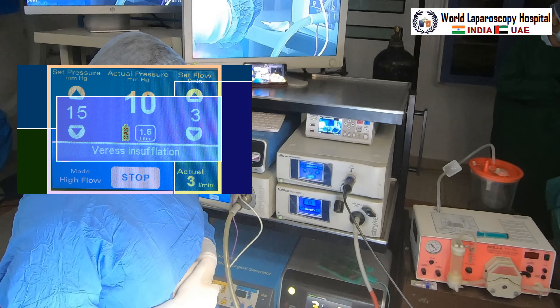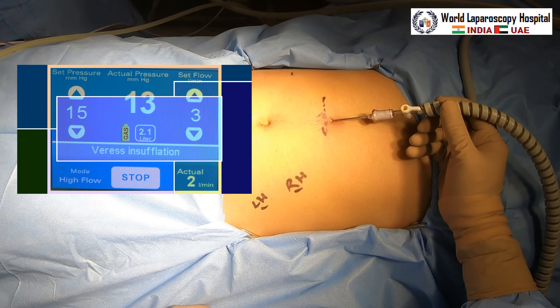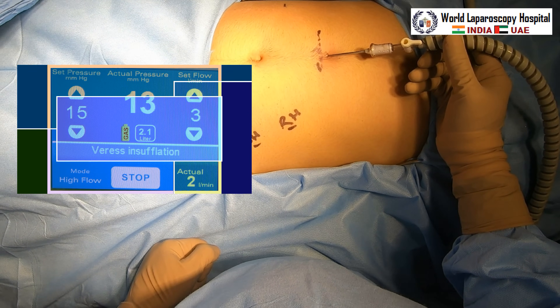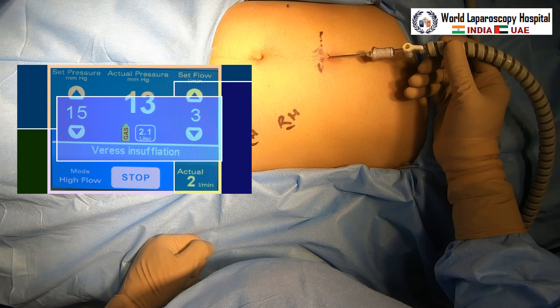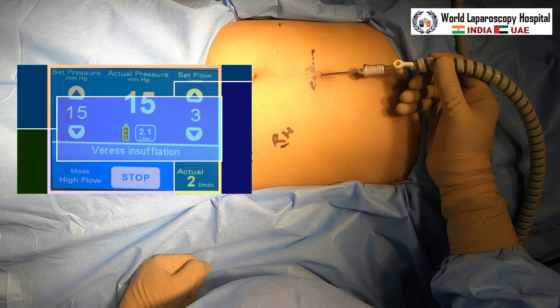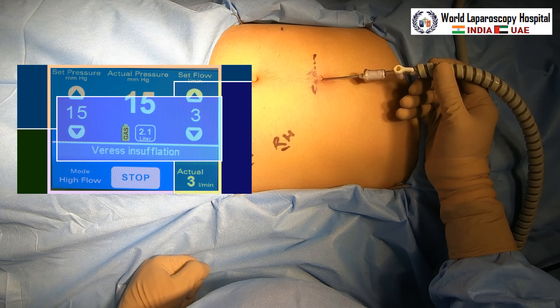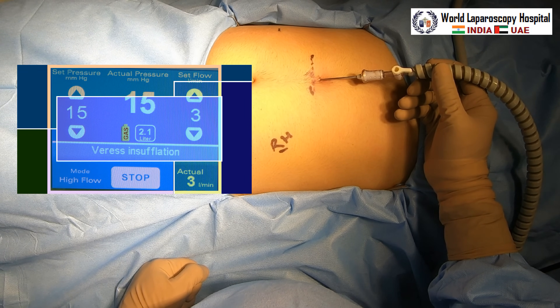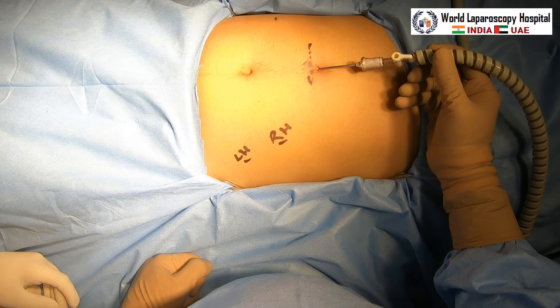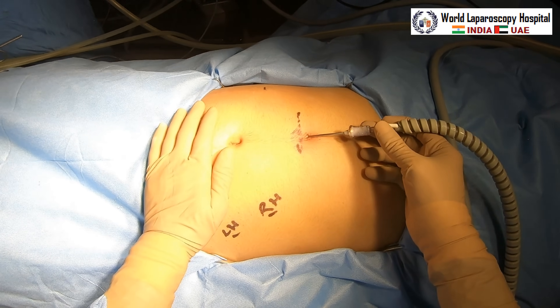After one liter of gas you can increase the flow rate to three liters per minute. Even at three liters per minute, the Veress needle eye will not allow gas to flow more than 2.5 liters per minute. For safety, do not exceed that, otherwise there may be air embolism. Now we can see 15 mmHg is achieved, and you will see the actual flow rate in the lower right corner become zero. Total 2.1 liters of gas have gone in, giving homogeneous distension all around.